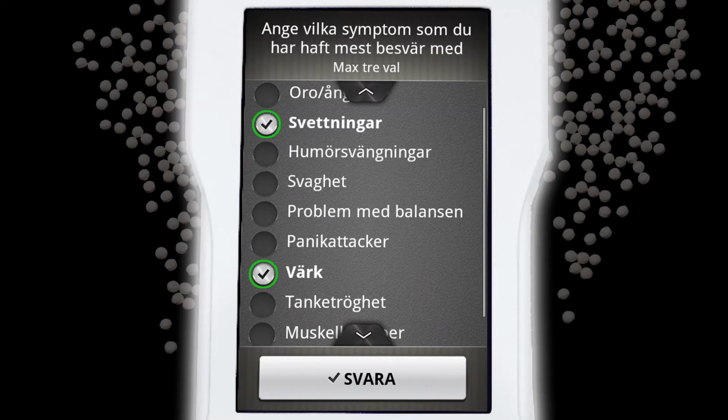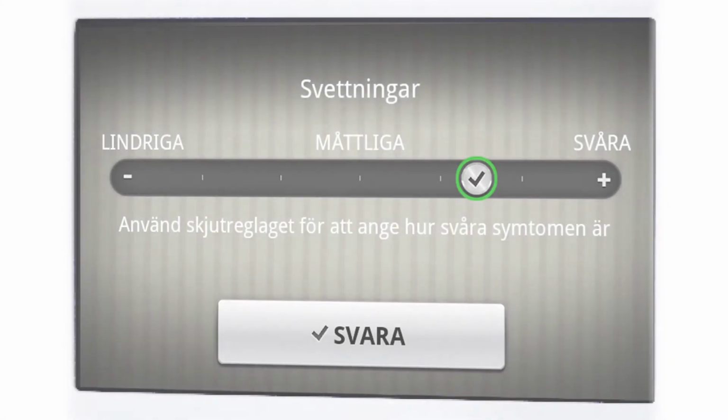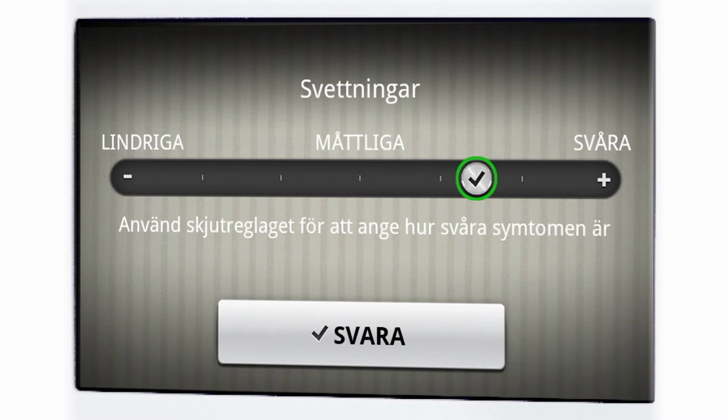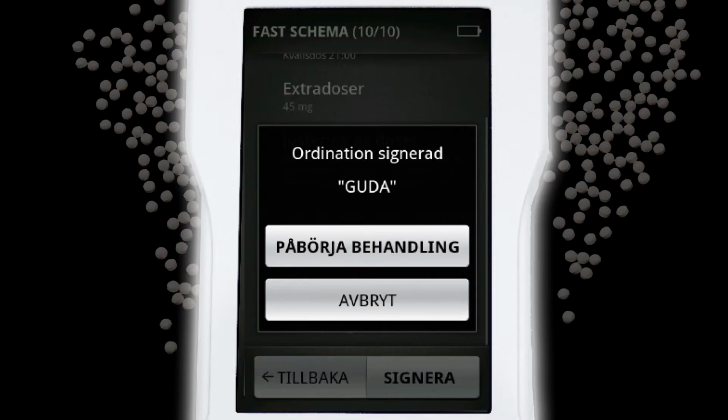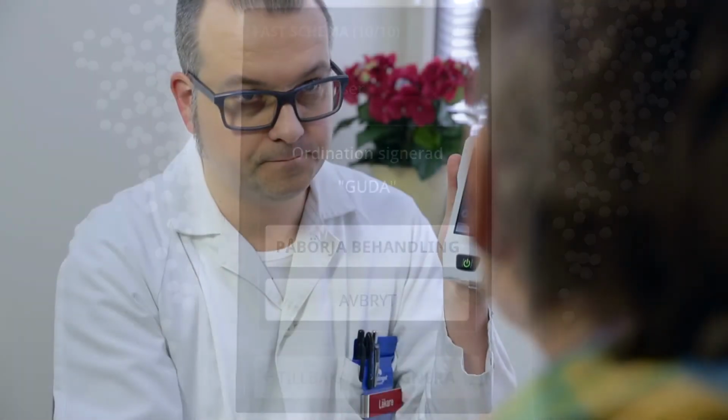Next, the patient will estimate non-motor symptoms. They are displayed immediately after the estimation of mobility. In this example, the patient has responded with presence of 2 non-motor symptoms. After the selection of the type of symptoms, the patient quantifies the severity of symptoms selected using the same scale as before. The programming of the prescription is now finished. Check that your initials are correct. Then press the Begin Treatment.